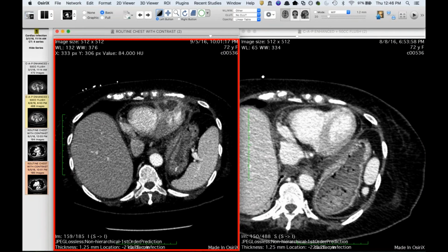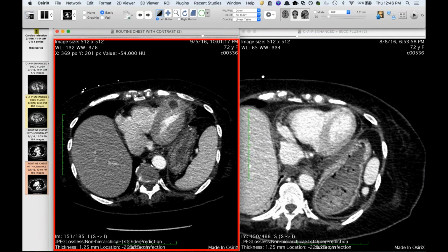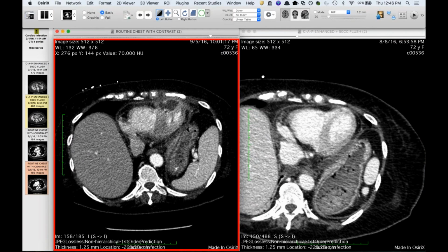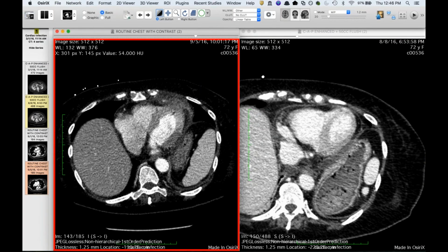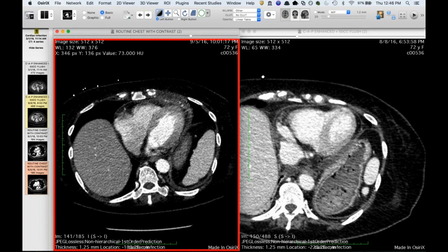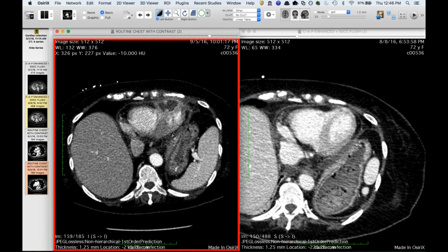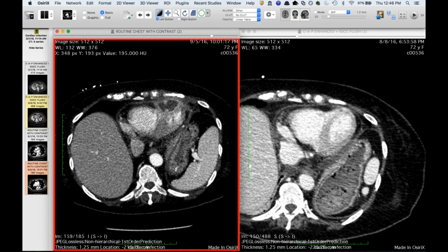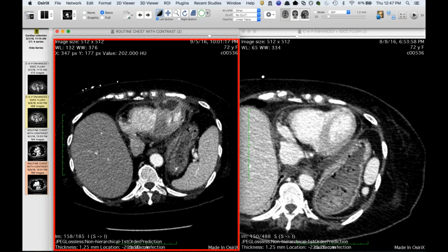So Travis, it's very loculated because most of the anterior pericardium there looks pretty normal. Yeah, it's a little thickened, or there's a little bit of fluid here, but you're right, it's very loculated. And you can see there's a lot of inflammation I think in both the epicardial and the anterior mediastinal fat. Yeah, and like I said, unfortunately, she was not in any shape to get, her platelet count was close to zero, and she eventually was just sent home on hospice.